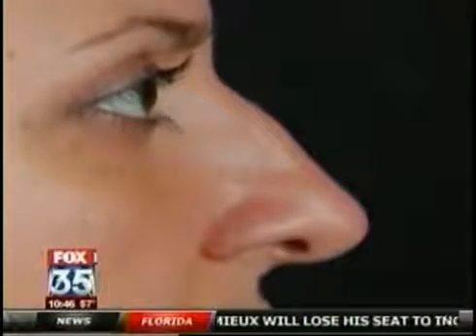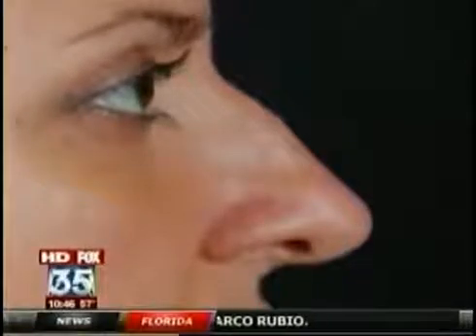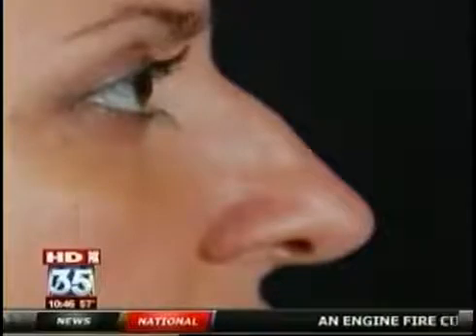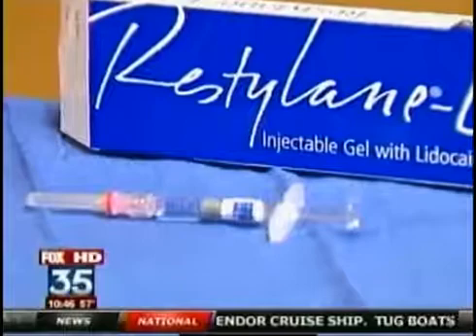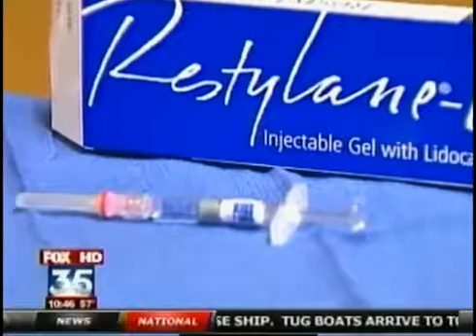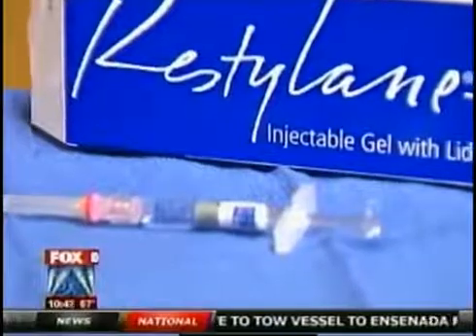But Dr. Roger Bassin of the Bassin Center says it's not for every person who's unhappy with his or her nose. "A lot of what we're seeing with this type of procedure, patients who just have that little bit of a dip in between the areas of the nasal bridge as it gets to the center of the nose. I really wouldn't recommend this for somebody who has something that we would call a misaligned nose, or something that's a little bit diverted when you're taking a front view, because that's more of a structural issue that would really have to have a structural type of procedure to fix that."